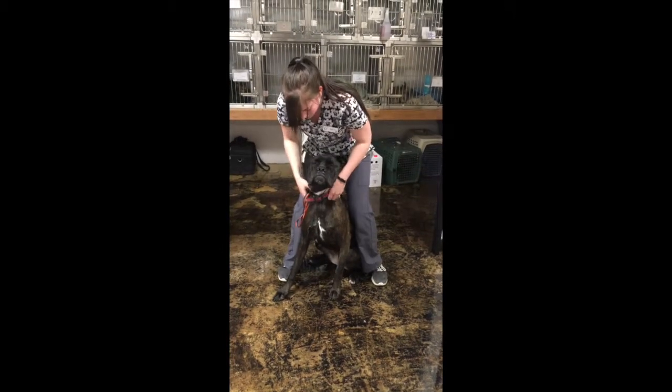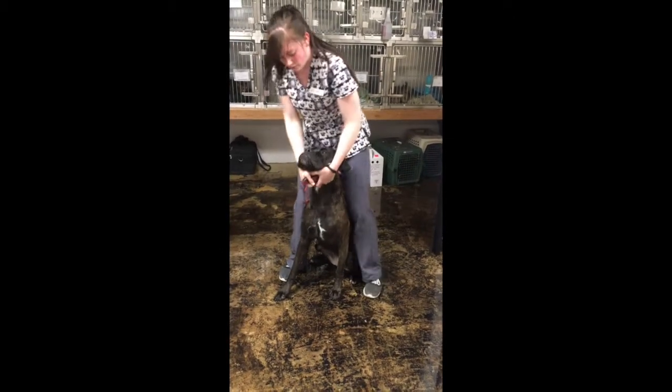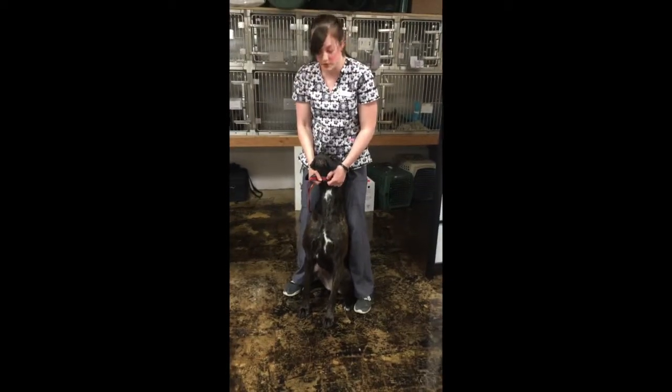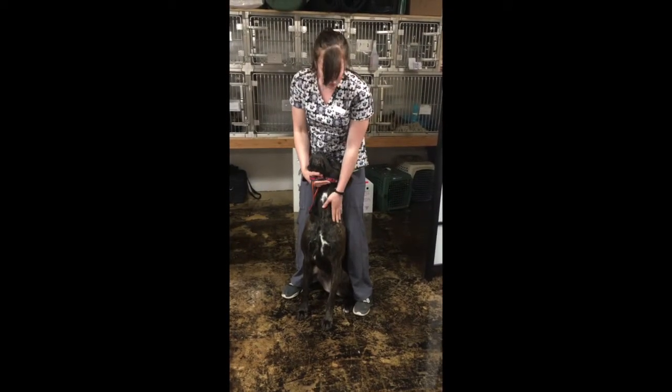Next, for the jugular, we want to go ahead and pull up her collar, have her in between my legs, making sure that she couldn't go anywhere if she tried to wiggle, and that gives the drawer access to the jugular vein.